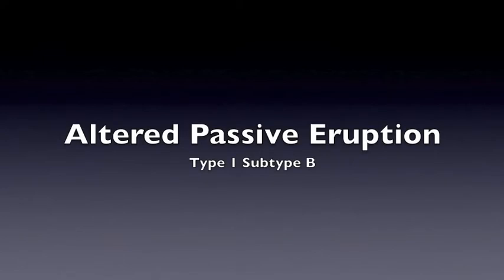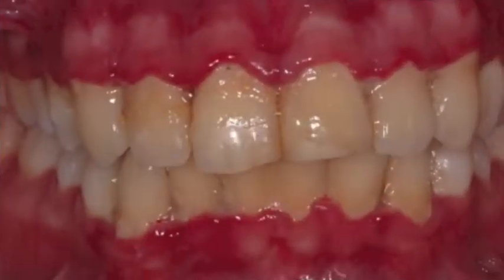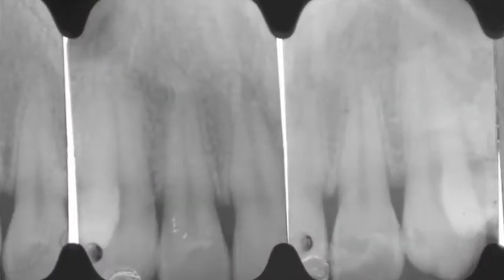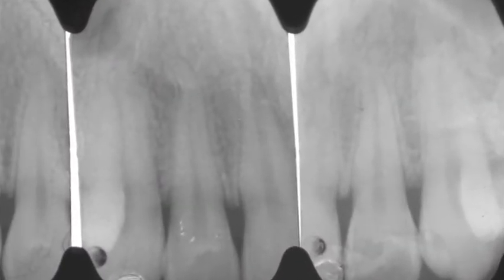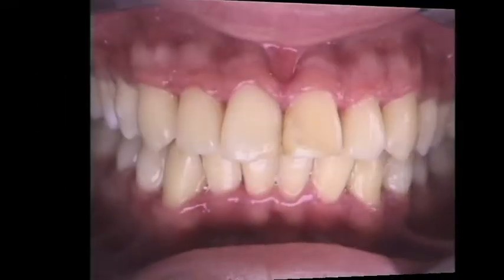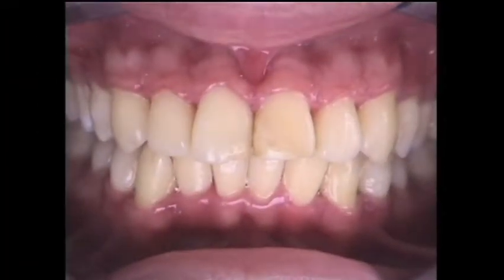Hello everybody. We are here today to talk about altered passive eruption. Today we are dealing with a case of type 1 subtype B. As we can see, first of all we have to deal with oral hygiene. So the first phase of treatment will be to reduce inflammation as much as possible.